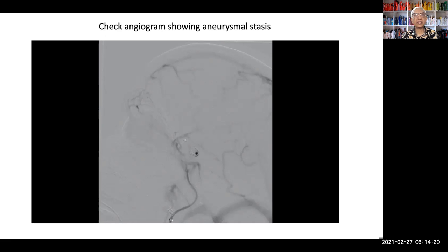We also showed you that the Surpass Evolve is an excellent flow diverter because this is a complex anatomy. You could see the curves. You could see a very, very tight loop with the stenosis proximal to the aneurysm. But all these segments were adequately treated by the pull push technique and a little bit of massage and finally the balloon to ensure adequate position. And we realized the balloon was not necessary for that tight loop.